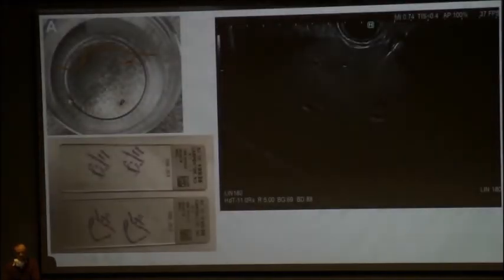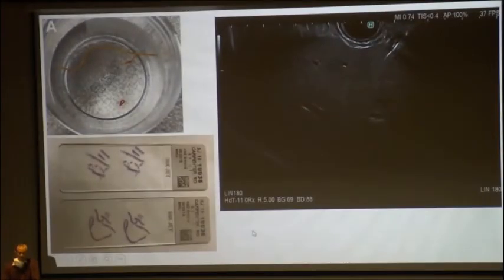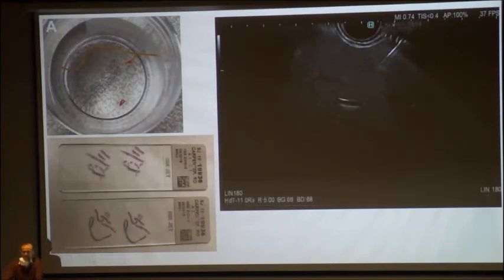The tissue sample length has been shown to be even more than 6 centimeters in a few studies, and as many as 30 to 40 complete portal tracts can be seen. And this is a linear US scope at the GE junction, where a 19-gauge FNA needle is being used, which is primed with saline with or without heparin, and just 1 pass is found to be enough. Even some studies have shown that even 1 pass and 1 actuation, that is just 1 to and fro movement, is found to be giving satisfactory results.